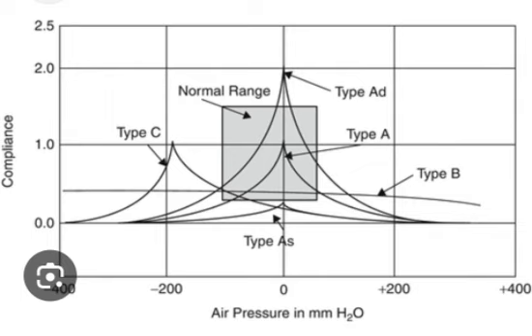Procedure. After an otoscopy to ensure that the path to the eardrum is clear and there is no perforation, the test is performed by inserting the tympanometer probe in the ear canal. The instrument changes the pressure in the ear, generates a pure tone, and measures the eardrum responses to the sound at different pressures. This produces a series of data measuring how admittance varies with pressure, which is plotted as a tympanogram. Tympanograms are categorized according to the shape of the plot.